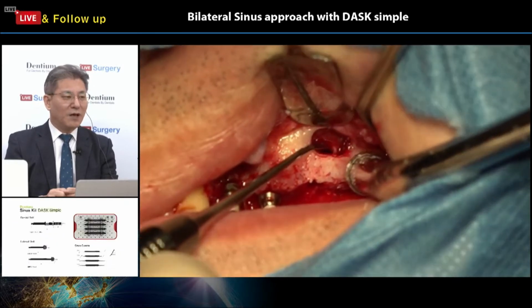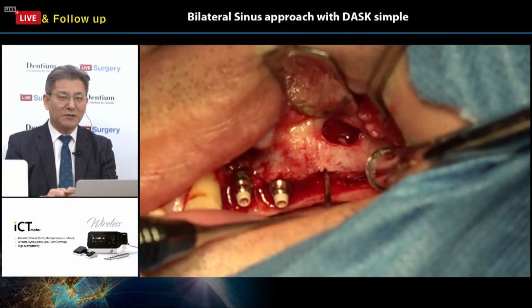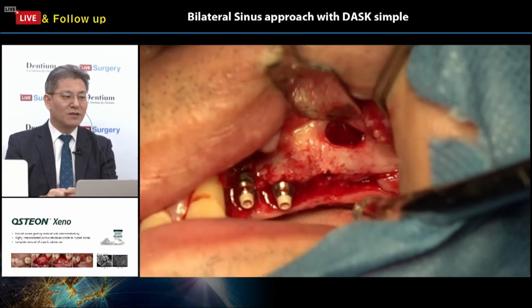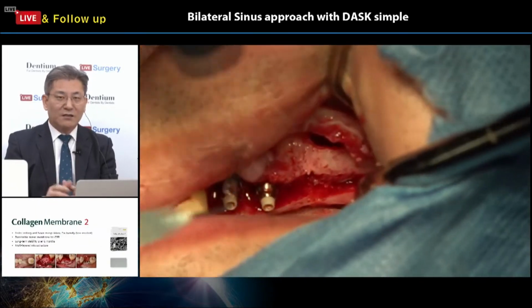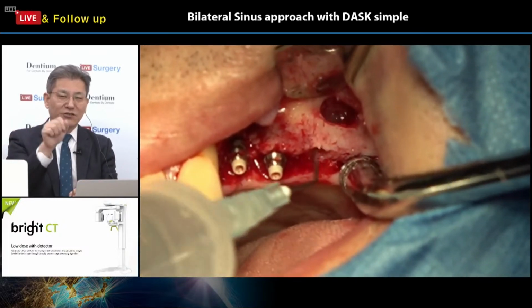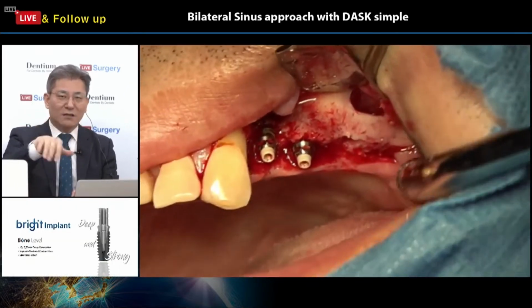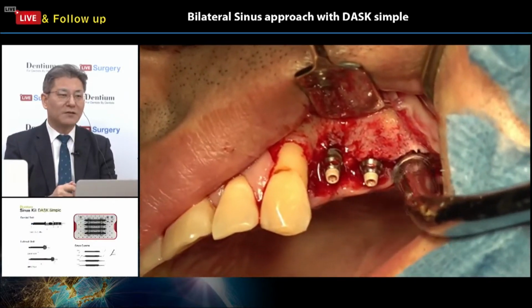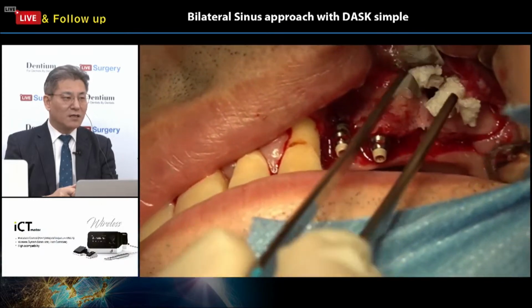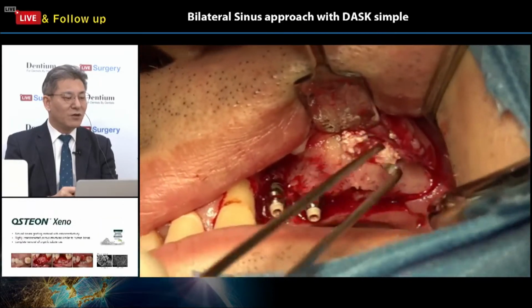So everybody makes sinus membrane perforation during sinus lifting. Especially with the crestal approach, it happens more frequently. So when we have a sinus perforation with the crestal approach, don't be scared. Make a vertical incision, wide reflection, and using the DASK drill, make a lateral window and use the elephant foot for the detachment of the sinus membrane, and the different angle sinus curettes will be applied for sinus membrane detachment from the lateral wall and the sinus floor. And now the bone grafting, the osteon 3 collagen is inserted.